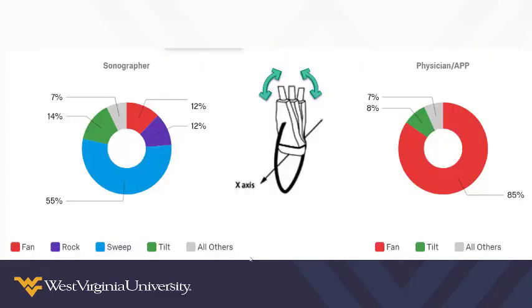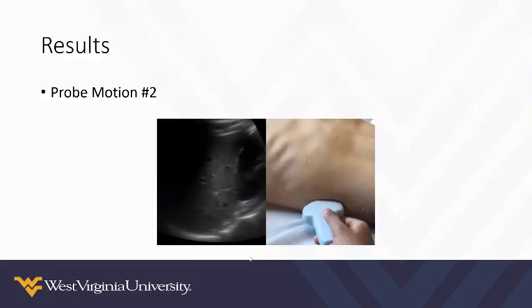As you can see, the majority of physicians referred to this probe movement as fanning, while the majority of sonographers referred to this probe movement as sweeping. Here we have our second probe motion.